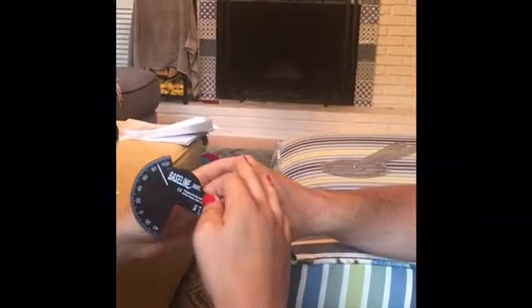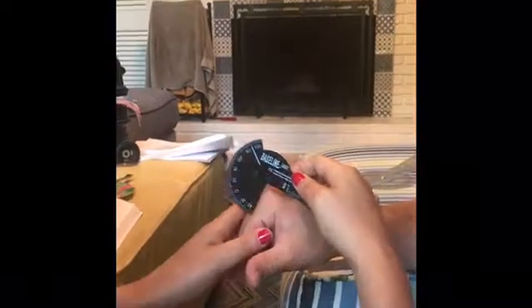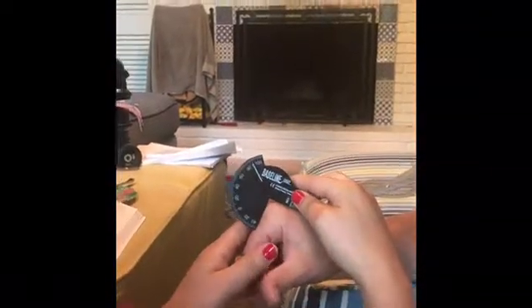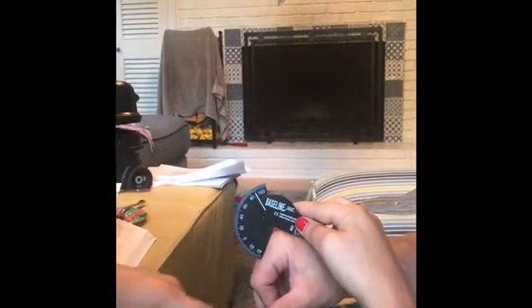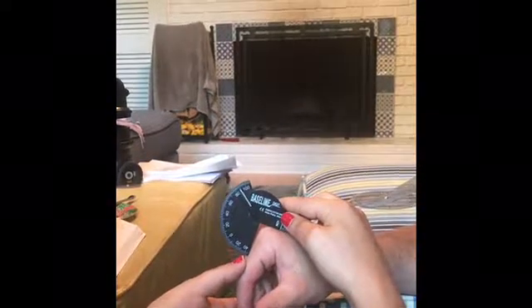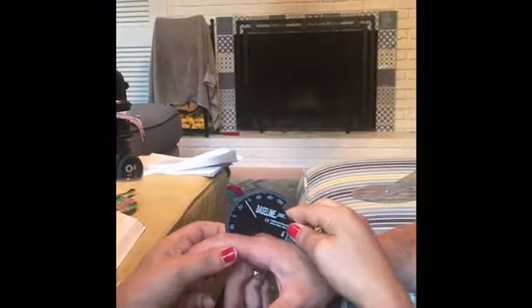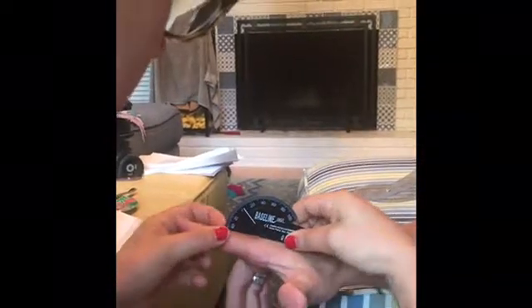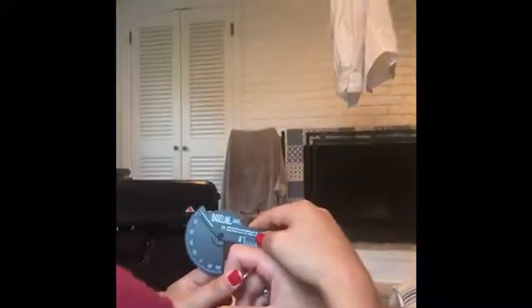We're going to be measuring range of motion of the finger MCP extension. Typical range of motion is 90 to 0 degrees, so we're going to start at 90 here. And the axis is the dorsal surface of the MCP joint of the finger. Stable arm is midline of dorsal surface of the metacarpal of the finger, and moving arm is midline of dorsal surface of the proximal phalanx of the finger. So we're going to go ahead and bring it up to 0. There we are. Cut.